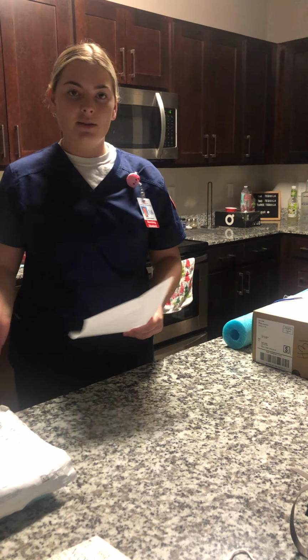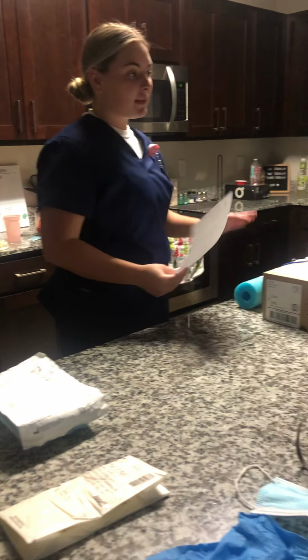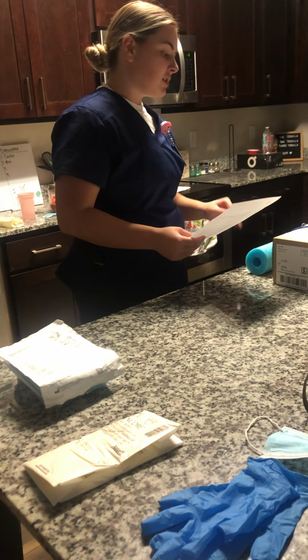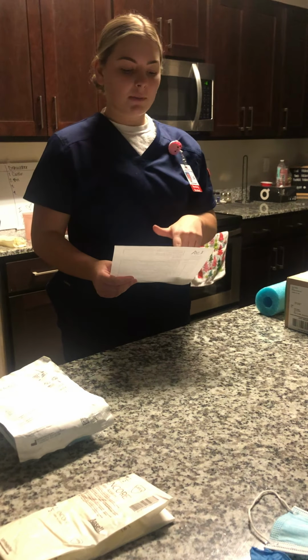So the first thing that I'm going to do is I'm going to verify the order, and I'm verifying the hospital policy. I do want to make sure that this is my correct patient, so I'm going to use his name and his date of birth, which is August 25th, 1963. So this is Mr. Jack Wright Jones. His date of birth does match up. So I did use his hospital bracelet and hospital care order form.